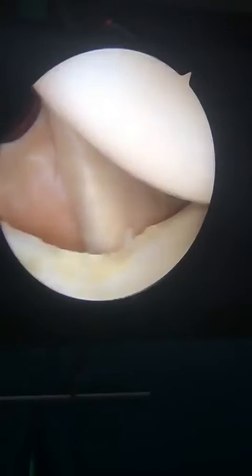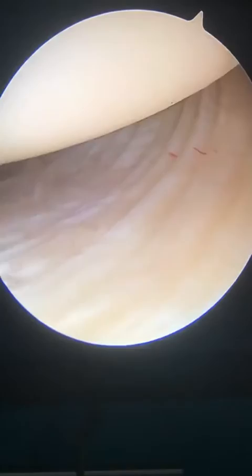If we look down lower here, this is the anterior labrum of the shoulder. You can see the ball and socket here. And if I drive through a little bit further, this is our axillary pouch, where loose bodies can also be found.